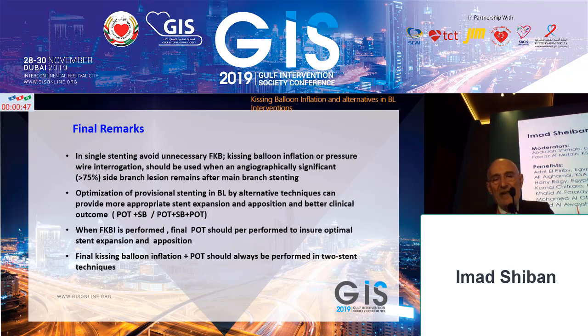Optimization of provisional stenting in bifurcation lesions by alternative techniques can provide more appropriate stent expansion and apposition and better clinical outcome. When kissing balloon inflation is performed, final POT should be performed in order to ensure optimal stent expansion and apposition. And I finish saying that final kissing balloon plus POT is mandatory always when you are performing a two-stent technique.